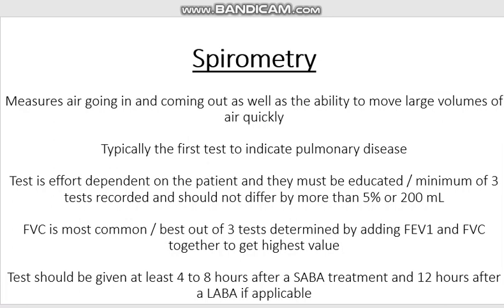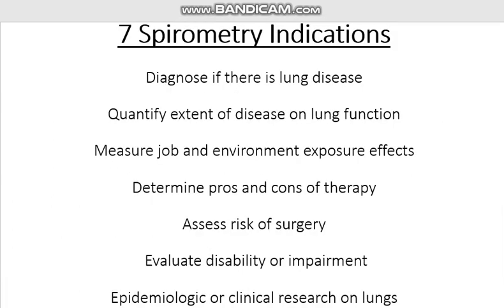LABA if applicable. 7 spirometry indications are to diagnose if there is lung disease, quantify the extent of the disease on lung function, measure the patient's job and environment exposure effects, determine the pros and cons of therapy, assess the risk of surgery, evaluate for disability or impairment, and for epidemiologic or clinical research on the lungs.